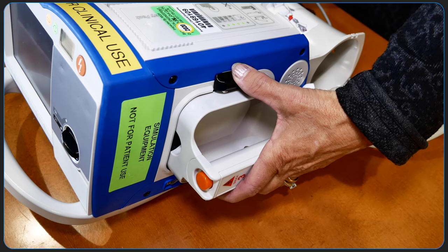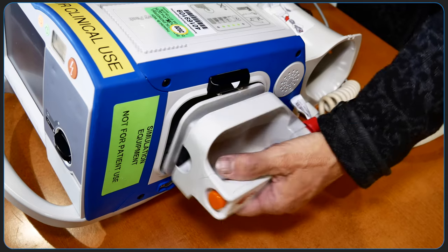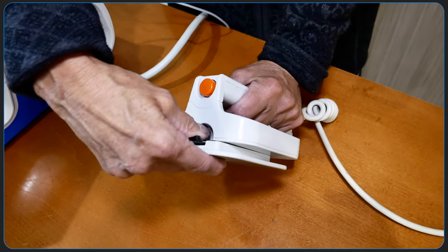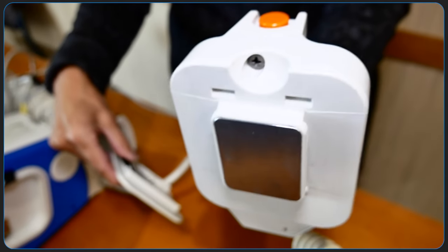External paddles with electrolyte gel can be used for defibrillation and synchronized cardioversion. To release the paddles, grasp the handles and press down on the latch button above each paddle. Pediatric-sized electrodes are also built into the paddle assembly. To expose the pediatric plate, press the PD button at the top of the paddle, then slide the adult plate upward.